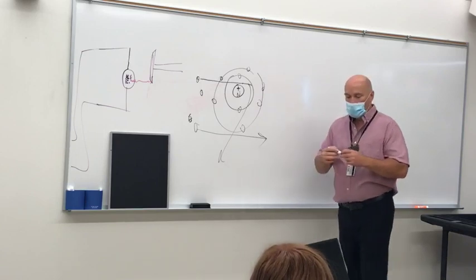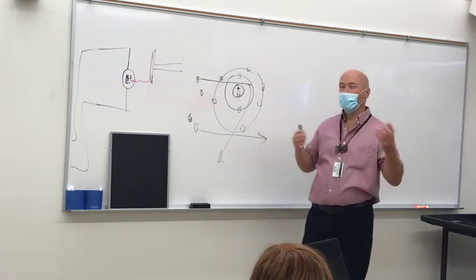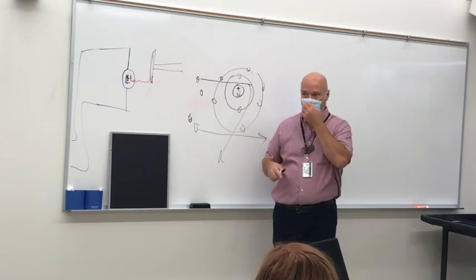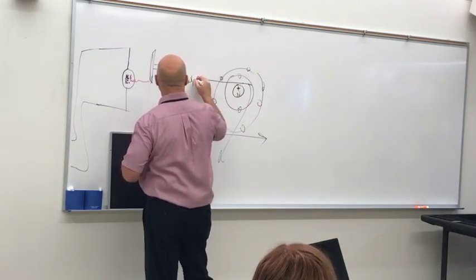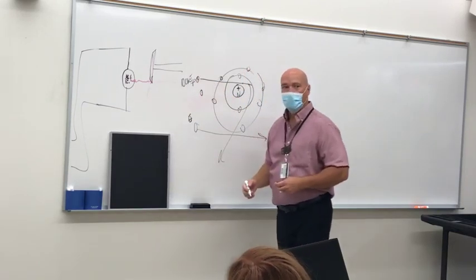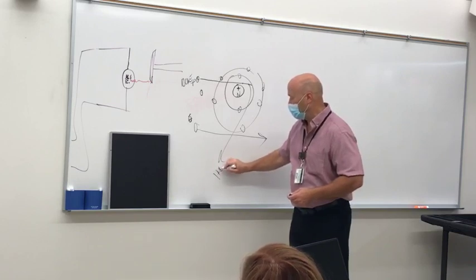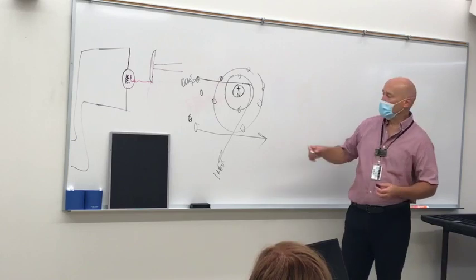According to the law of conservation of energy, we don't really create or destroy energy, we just transform it. So if this thing is screaming in with 100 kVp worth of potential difference, which we're really going to call keV, but it's really the same thing, and it leaves with 1 keV worth of potential difference, where did the other 99 go?